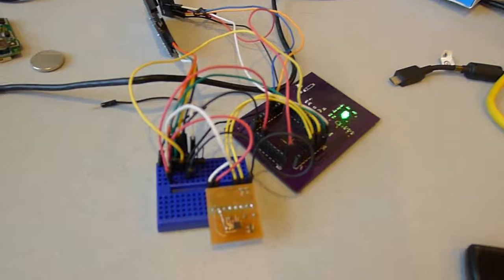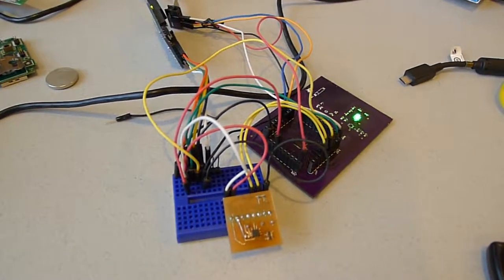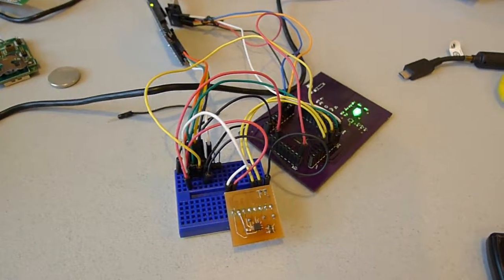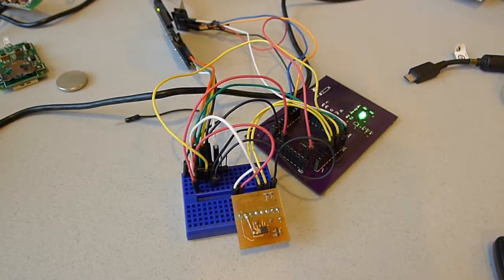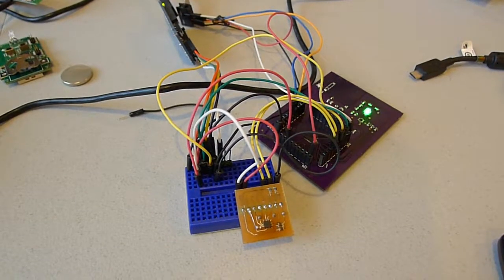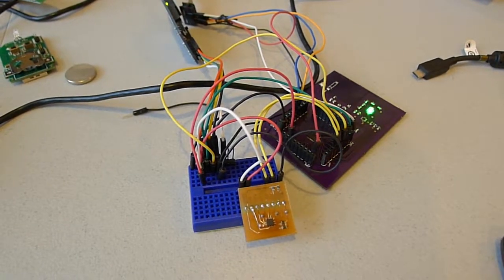The prototype looks kind of ugly with all the wires hanging out, but that's not what's going to be in our final prototype design.